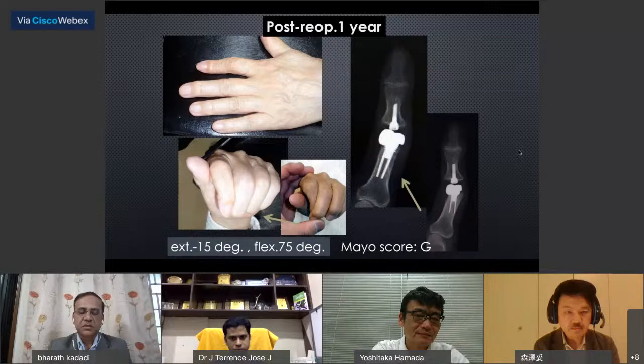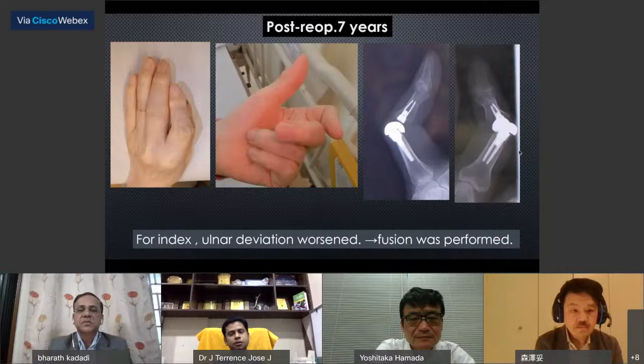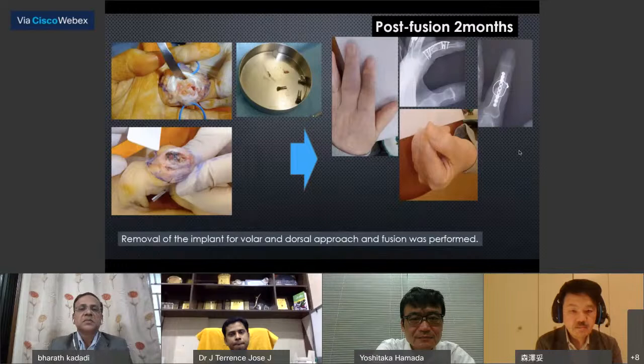Post 7 years reoperation, index ulnar deviation worsened and she could not pinch, so fusion operation was performed. I removed the implant by palmar and dorsal approach and fusion was done with plate and iliac bone graft. Post 2 months after fusion, she had no pain and could pinch well.